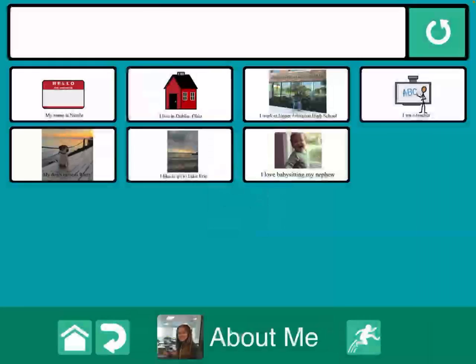We'll send all of our students with AAC devices, even if they have Proloquo or LAMP. We download GoTalk because it allows them to input pertinent information over a student's winter break, summer break, spring break, weekend, that we can know what students are doing, and then they can tell us on their AAC device.